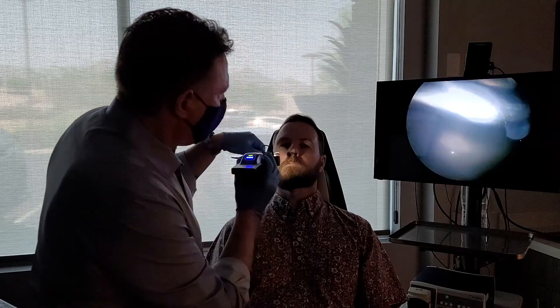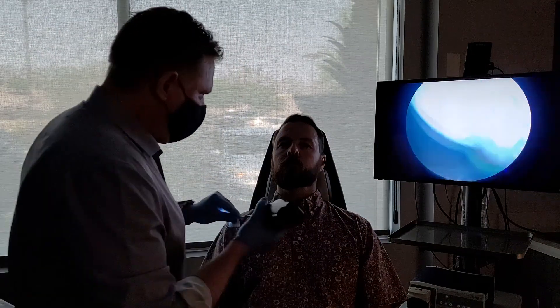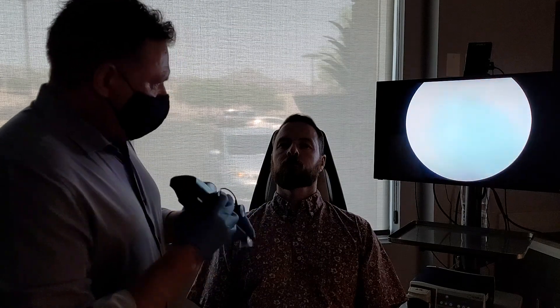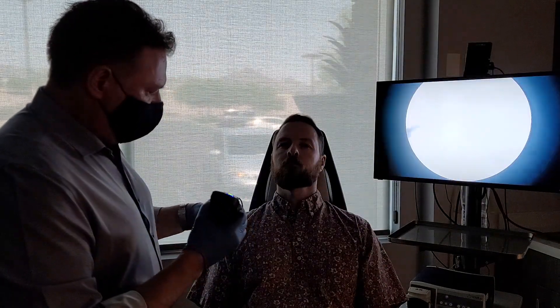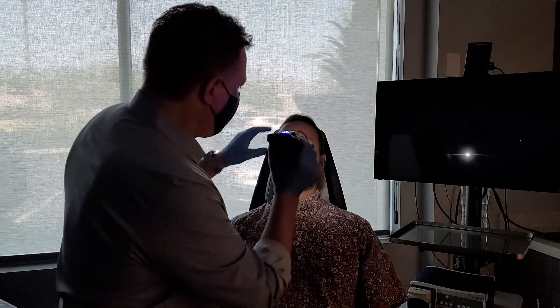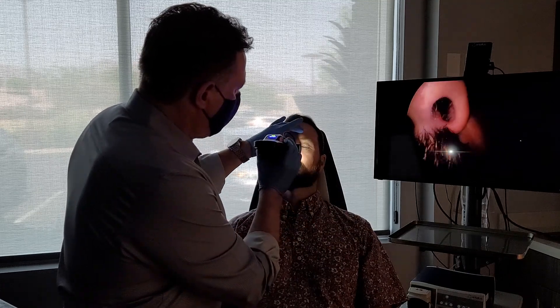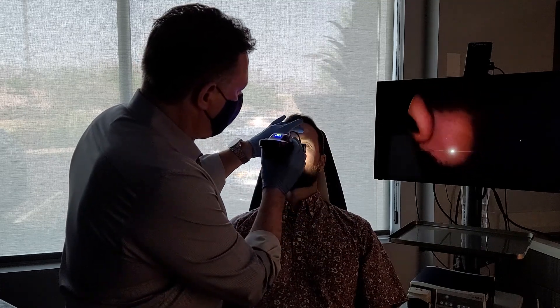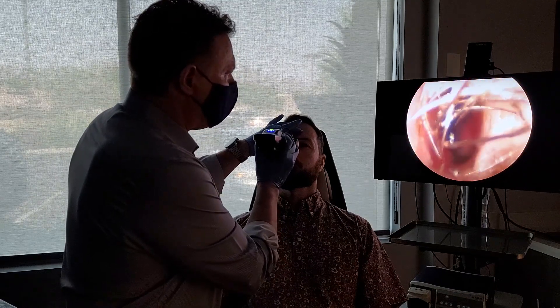Now we're gonna contrast that with the scope. I'm gonna use a little alcohol wipe — this is gonna clean it but it's also gonna give us a little bit of an anti-fog property. Now we're gonna take a better look inside the nasal cavity with the scope. I'm putting my fingers on Kevin's forehead, my other finger is on the tip of Kevin's nose so I can guide the scope into the nasal cavity.